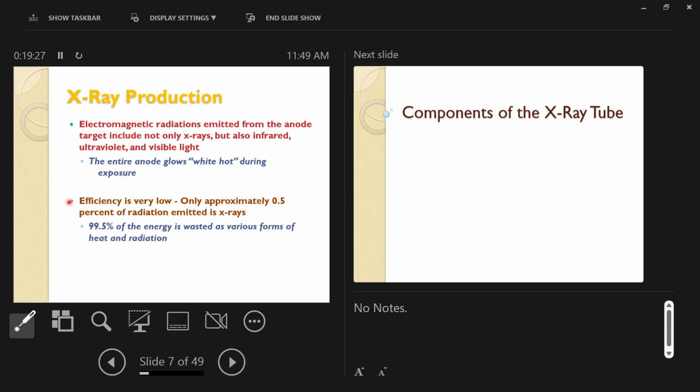and warp the bearings that support this anode. The bearings heat up. You can hear these bearings, right? These are old, used up bearings making lots of noise. Does anybody have an X-ray machine that sounds like that when you turn it on? Sounds like bearings rubbing together. Some do, some don't, right? And you might notice that if yours doesn't, it might start to make some louder noises towards the end of the day. As it gets hotter and hotter and hotter, everything kind of gets a little looser, making more noise.